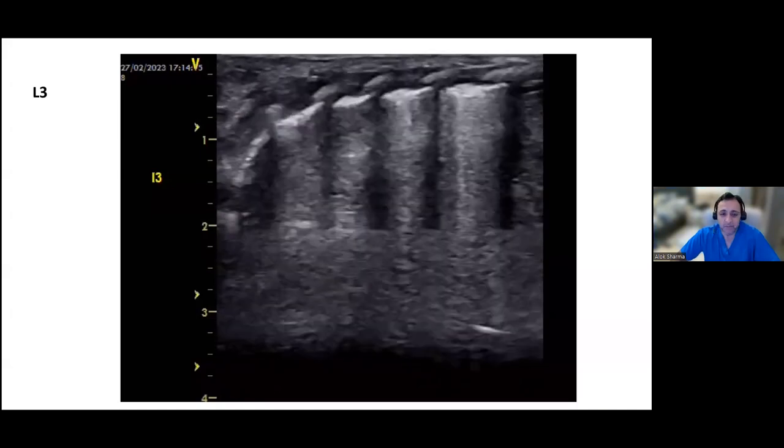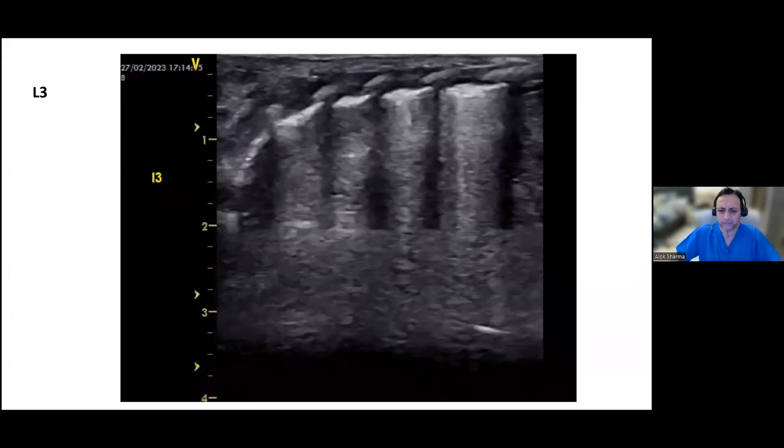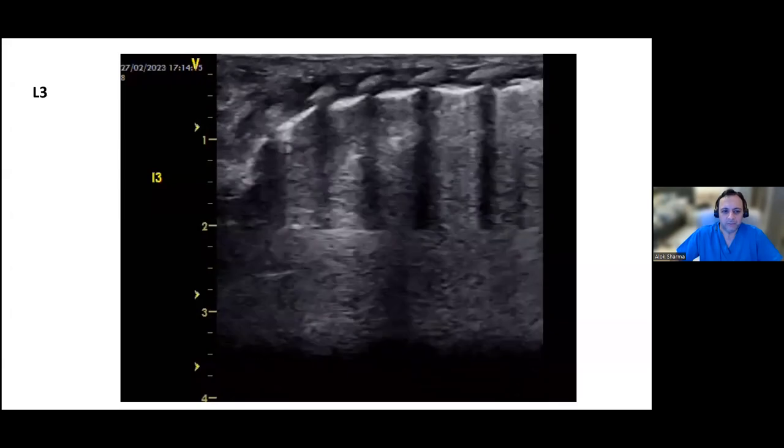But yeah, dominant B profile, slightly unusual considering. So how old is the baby? Baby's 4 hours old. Okay. So you have transitioned more on the right side anteriorly. Left side looks wet in the L3.